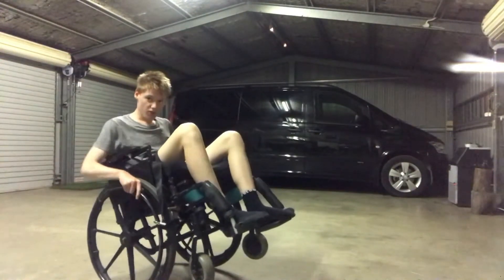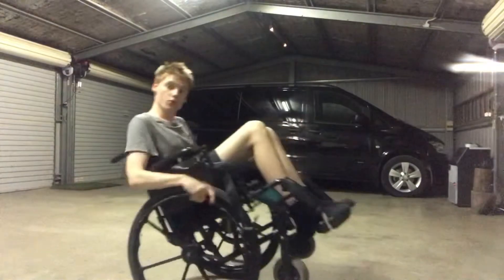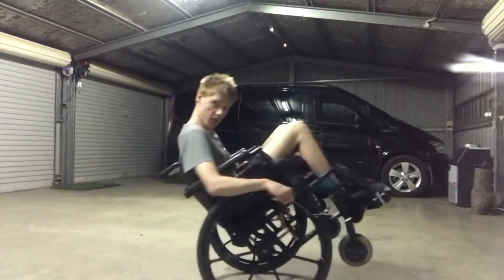To balance yourself, you want to wiggle your wheels back and forth. If you start to tip back, you want to wriggle your wheels back. If you start to tip forward, you want to accelerate.